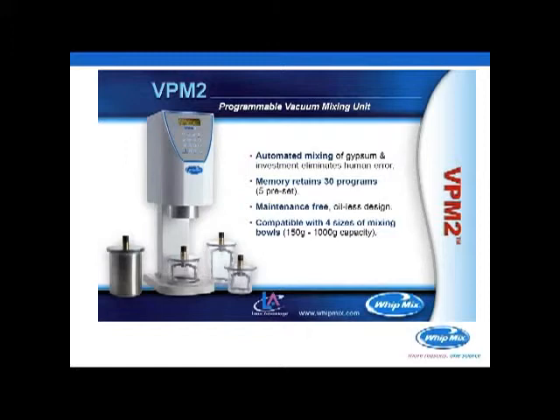However, if I can use the example of Formula One, phosphate investment needs to be mixed for 2 minutes. Now, unless you're watching a timer, the chances are real good that you're going to either mix short or mix long on that 2 minutes. And either way, standing there holding a bowl, doing nothing more than that for 2 minutes, however many times a day you do it, is sort of a waste of time.